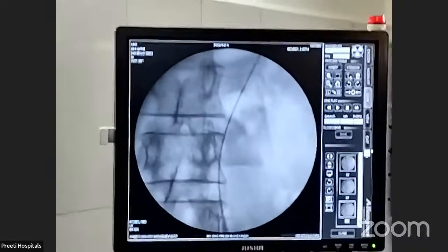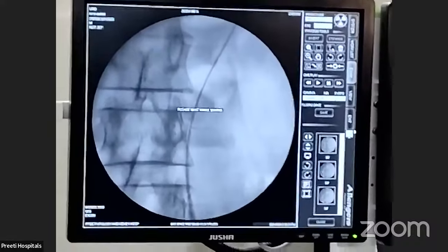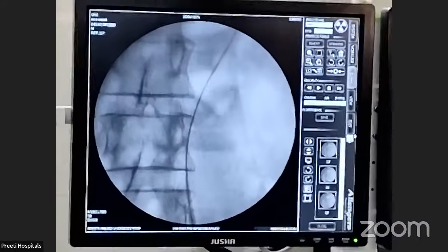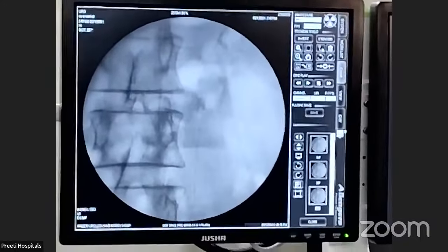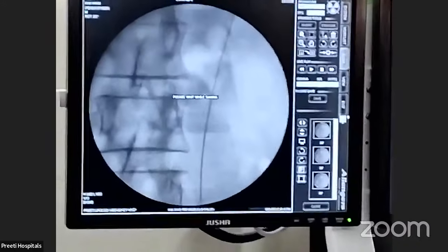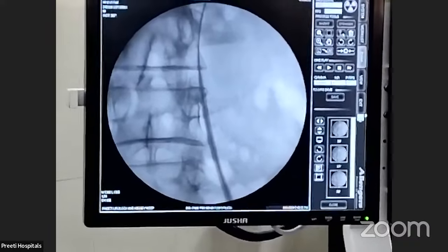Now, I am passing. Even in a post-stented ureter, this is going with a little difficulty. C-arm. So, I will withdraw. C-arm below.